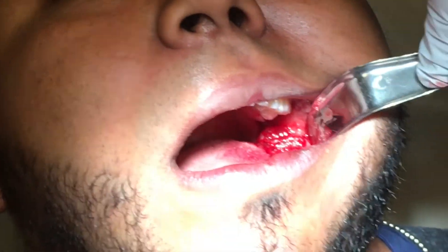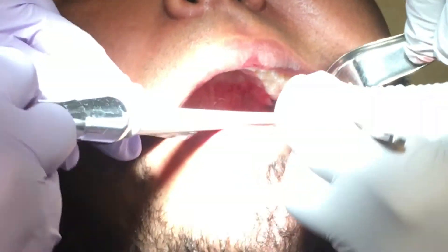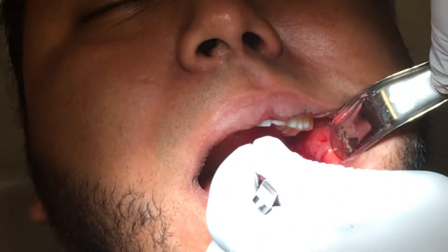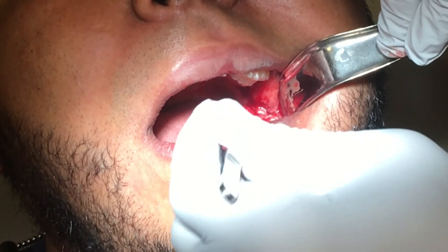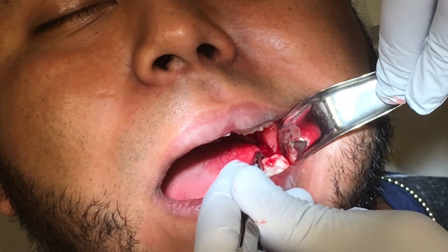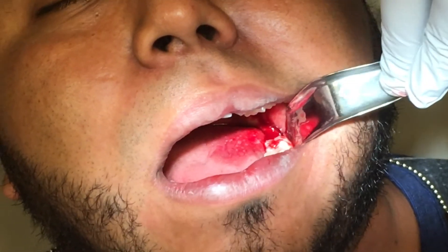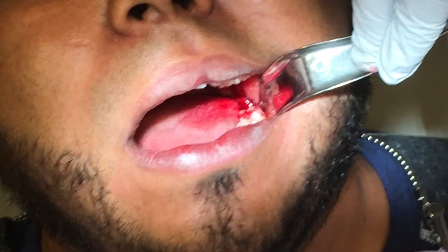Now I'm going to take our platelet-rich fibrin and suction it in there — I'm gonna place that down into the site. I'm gonna place one little stitch in here to close this up nicely. And that's how you properly take out a chronically infected wisdom tooth and use platelet-rich fibrin to cause it to heal well.